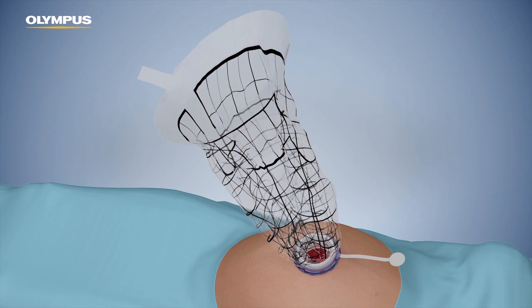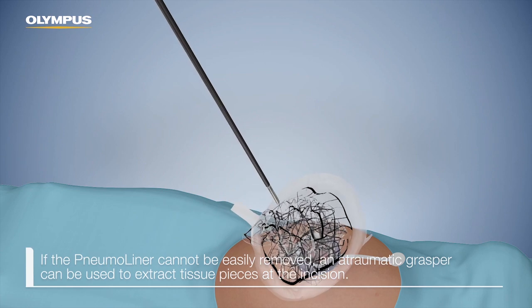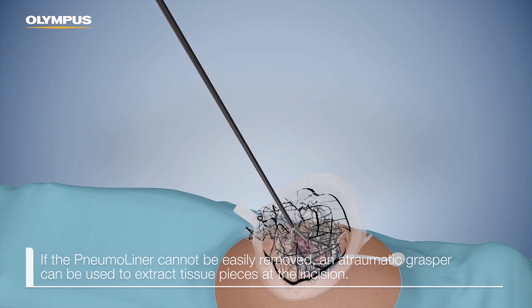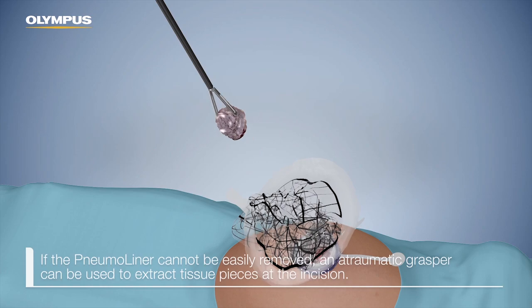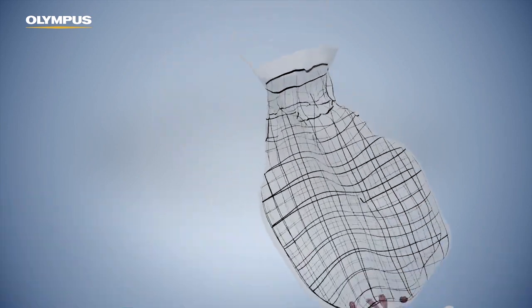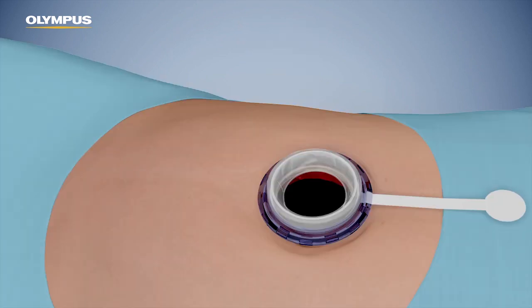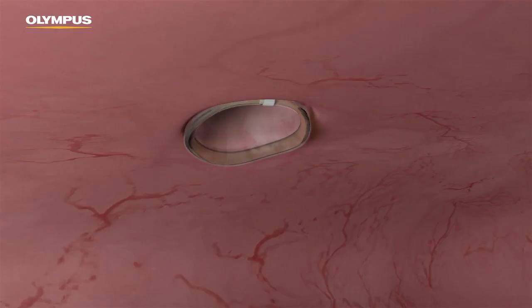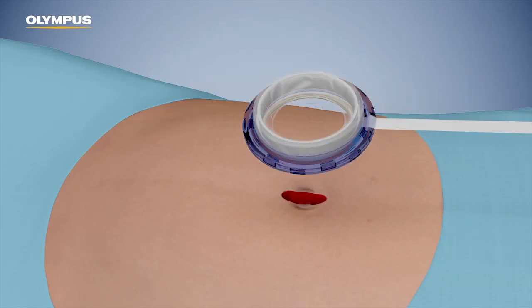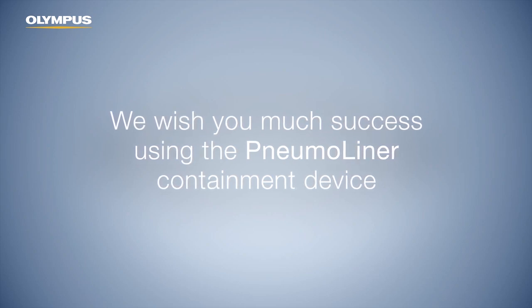Continue pulling back on the open neck of the pneumo liner. If the pneumo liner cannot be removed easily, tissue pieces can be extracted using an atraumatic grasper at the neck. Remove the retractor by pulling on the removal ribbon. We wish you much success using the pneumo liner containment device for morcellation.